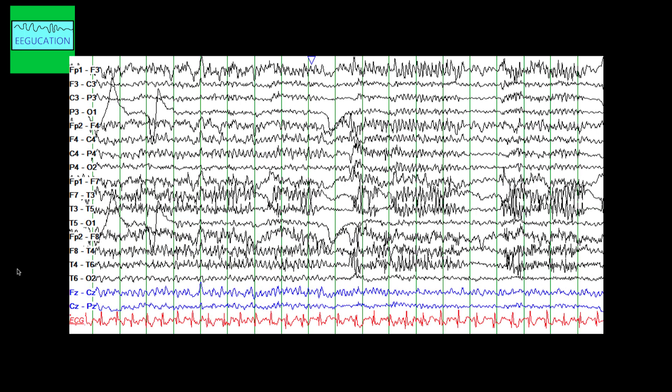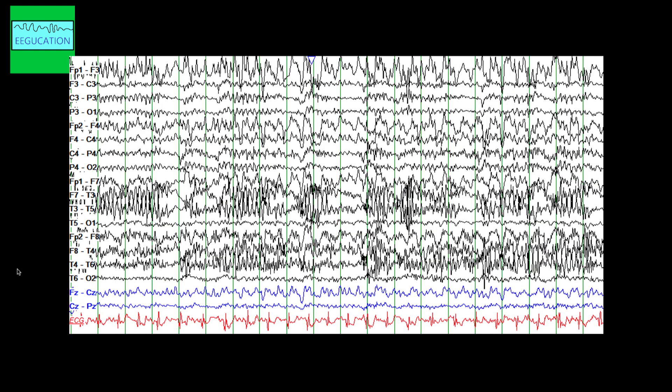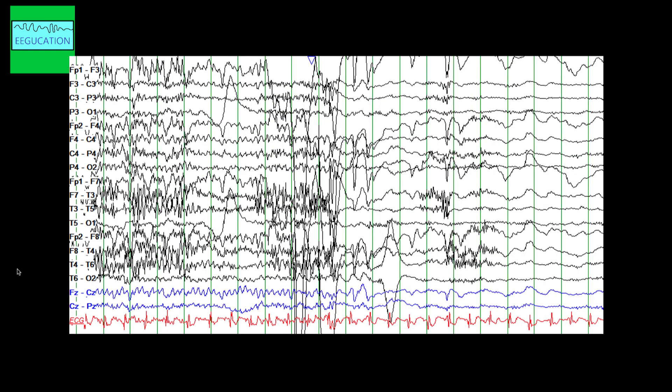This is a continuation of that EEG across subsequent pages. This is where the seizure ends — there is not much muscle or movement artifact, and the electrographic seizure is no longer visible. Ambulatory EEG can provide critical information and is very useful in people who are living alone, where there are no witnesses to say whether they are still having seizures or not.